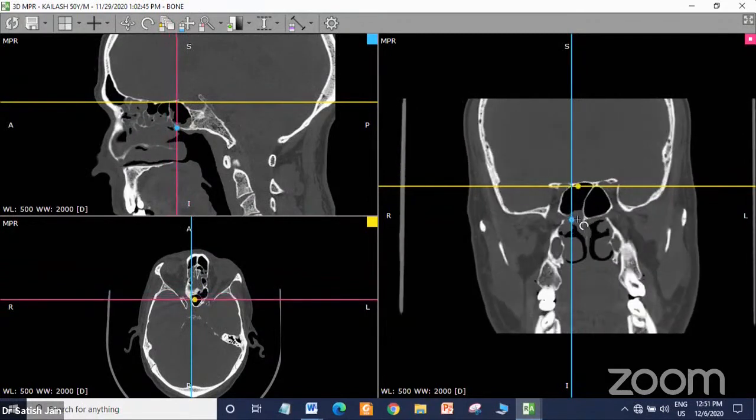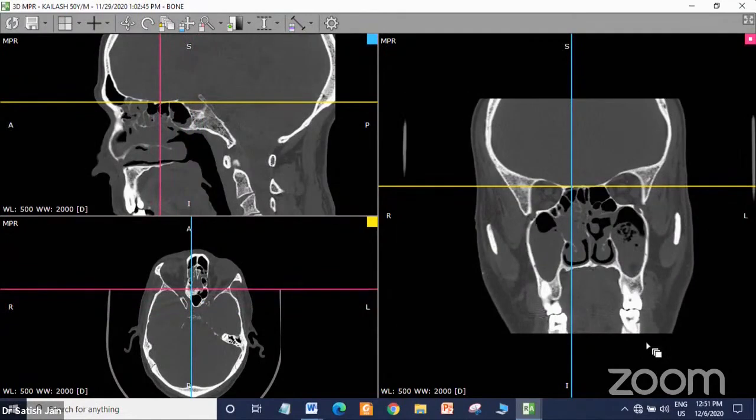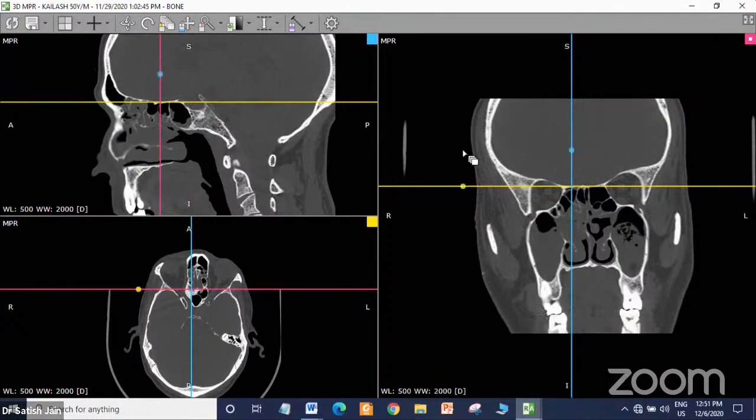Okay, Dr. Satish, one message to juniors, those who are not very conversant in radiology: it takes good time. Somebody asked about the DICOM software that can be downloaded. A free version is available on Google. And they must sit with the radiologist on the console and try to understand with him for the beginning. Is that the correct approach? Yes. Once you start acquiring your data on DVD, with this software only you can understand the entire radiology in all planes.